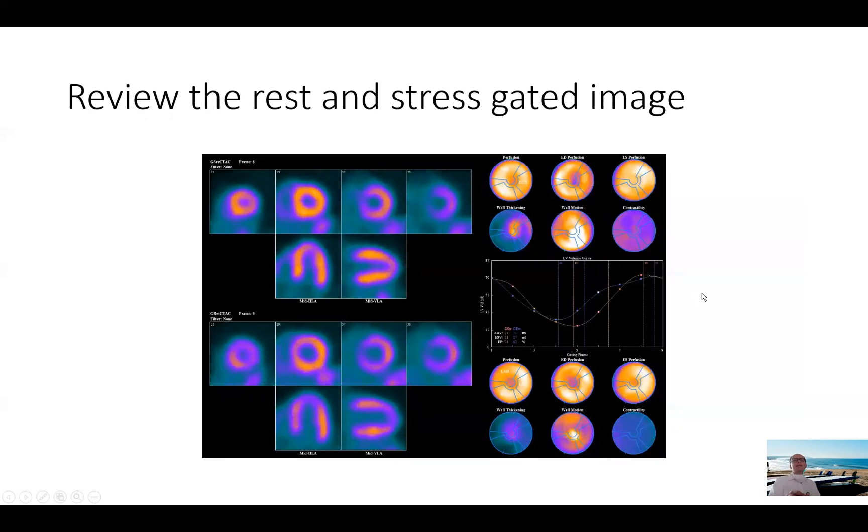The next images we look at are the gated images. With SPECT and with PET at least at our center, we look at both the rest images and the stress images. So we look at the motion, the wall motion, basically representing thickening, the brightness representing thickening of the heart during systole. We look at segmental wall motion and abnormalities if present. In this example, of course, this is a normal heart, so we don't expect to see that. And then we look at the ejection fraction in the rest and stress images seen here showing an ejection fraction, 62% at rest going up to 71% post-stress with the volumes also decreasing with stress.